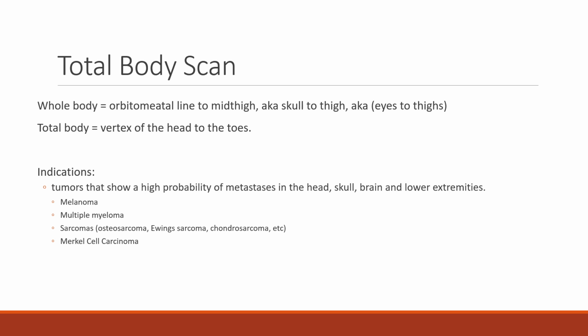Keep in mind the patient is already injected. So as far as the PET portion goes, there's no additional radiation exposure to them for that. But for the CT portion, there is. And so we want to limit that and not do the whole body if we don't have to.